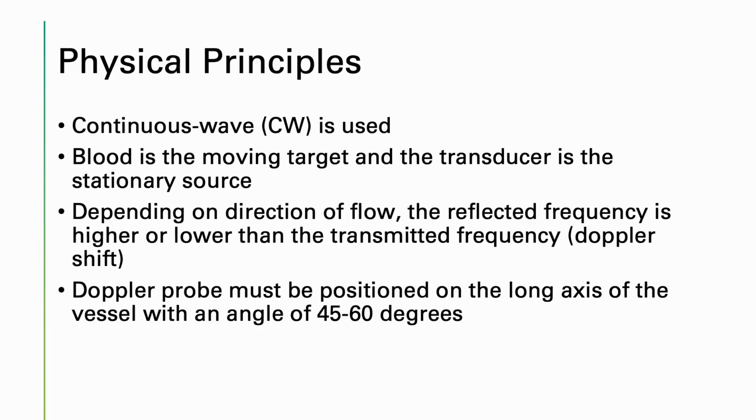And you all know this from working with the Doppler arterial machine, that you can find the pulse, but to get the correct waveform, you really need to get it on that 45 to 60 degree angle, which is hard to do, but you guys are doing great.